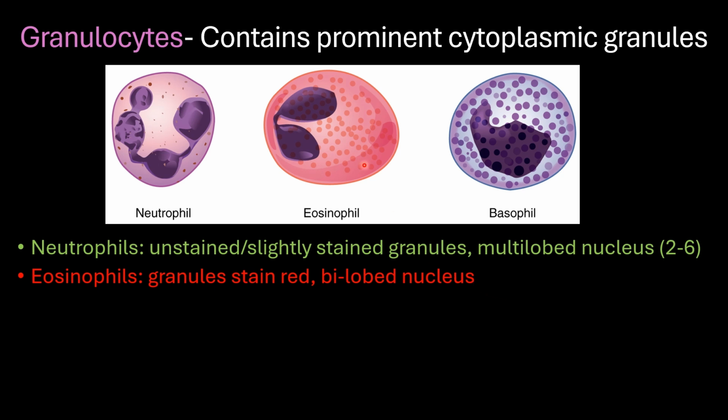Eosinophils. So the granules here stain best with a commonly used acidic eosin stain, thus they get their name eosin for the acidic part and phil for loving. Because of that color, they are pretty easy to identify. Their nucleus is most often bilobed right here, so there's 2 of them. So it appears that there are 2 nuclei, but they're really connected right here in the middle. Overall, they kind of have this alien head-looking appearance with 2 large eyes and a large head.